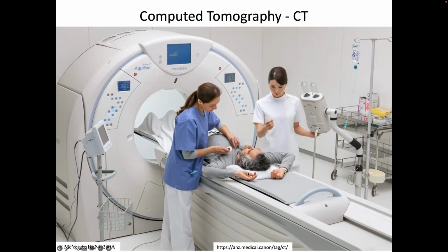It's also good in many cases just to have an ECG on a patient, because then you can tell how nervous they are, for one thing, right? So sometimes you get people and you just roll them in the scanner and you watch their heart rate go up, and it can get a little crazy. And so then the tech can calm them down, go in, hold their hand, stuff like that, just calm them back down. And so it's good to have physiological monitoring when you're scanning.